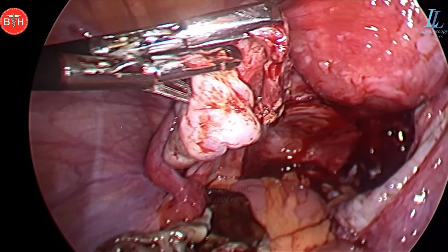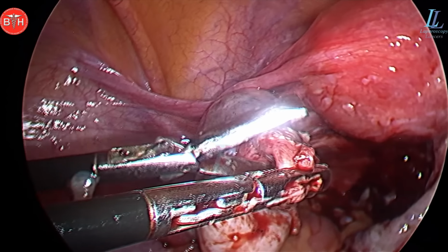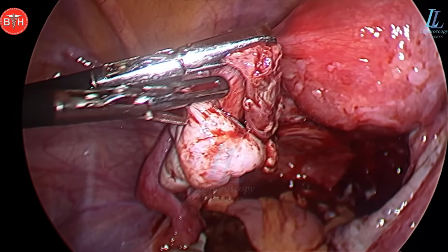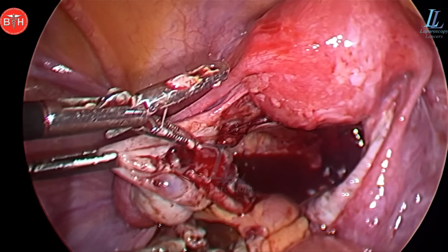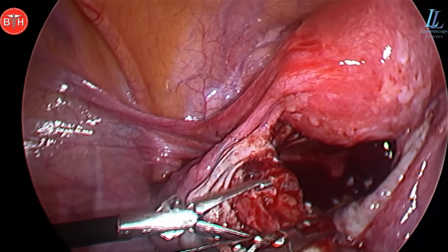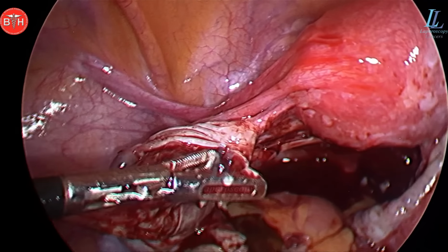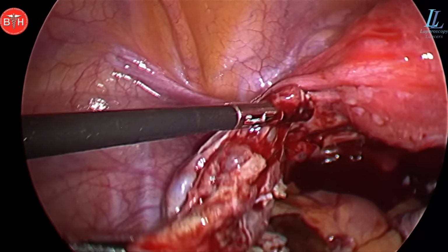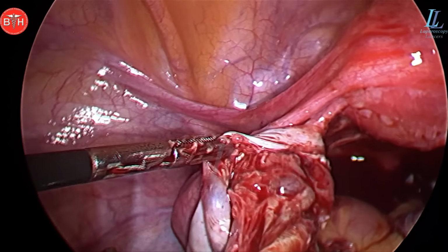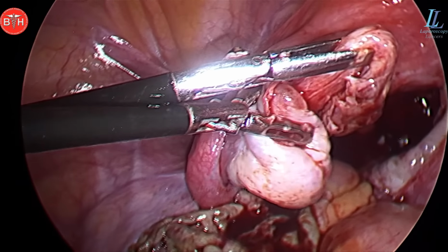And even laparoscopic myomectomy, again 3 ports are good enough, the 4th port is not required. Earlier we used to use the myoma screw almost in every case when we had no idea. Now obviously we have graduated, improving the skills. That is the most important thing. So there you can see the tissues are separating, traction and counter traction.